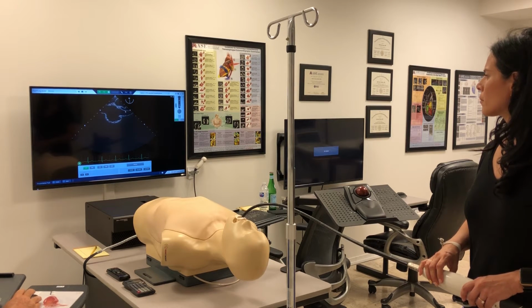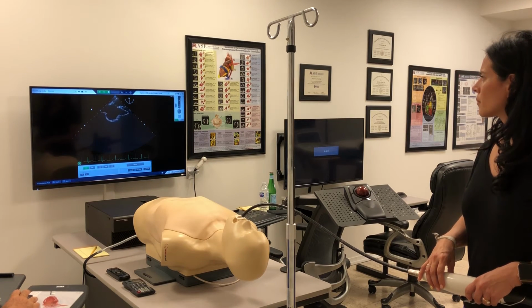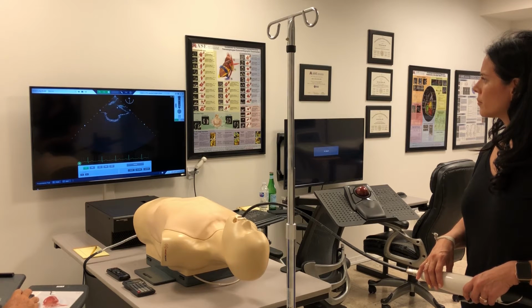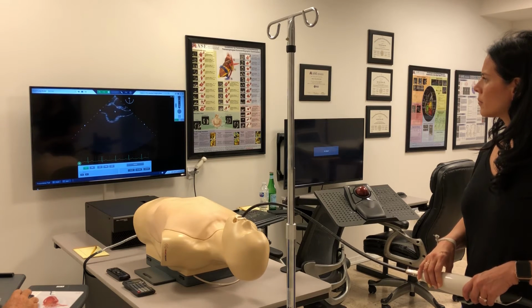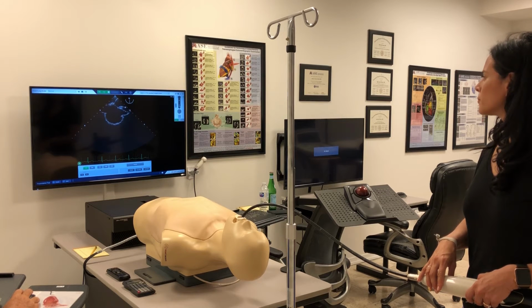Nice. So there's the superior vena cava. It's on the right screen, and the inferior vena cava is on the left screen. And you have a nice thin fossa ovalis surrounded by the superior and inferior limbus. PFOs will always be at this point here. They're always superior. The absence of this fossa ovalis will cause a secundum type ASD, which is clearly the most common type of ASD. Right up here, we're seeing a little budding of the right upper pulmonary vein.